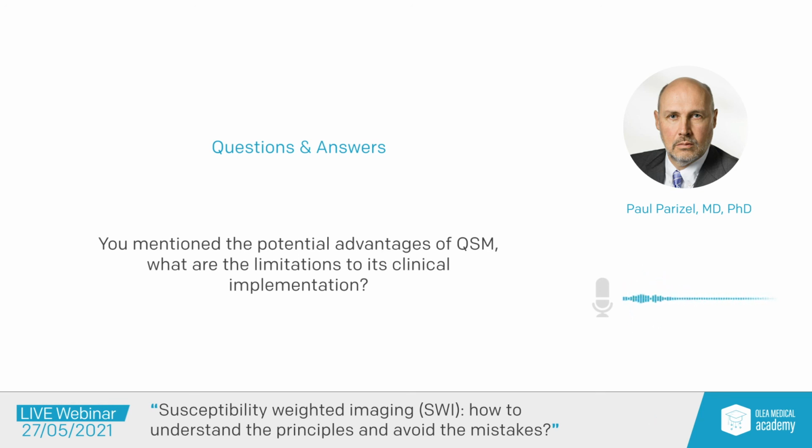And if that sequence would take longer, given the right indication and given the right clinical problem, I would be happy and willing to pay that price of a longer sequence if it means that I could get information about the chemical composition of the brain, which so far we have only been able to do with MR spectroscopy, but in a way that is not very spatially selective. So I think it could be something useful, but again, I have no personal experience with this as yet.